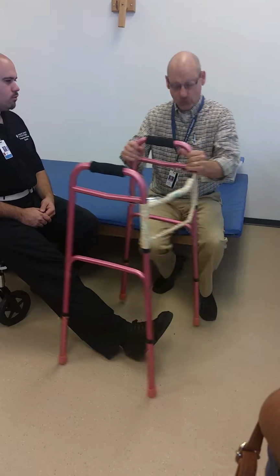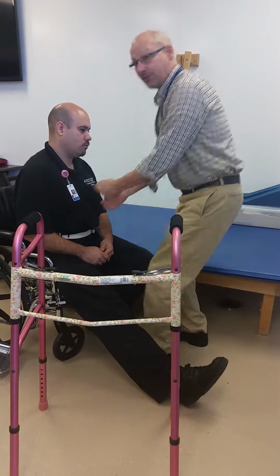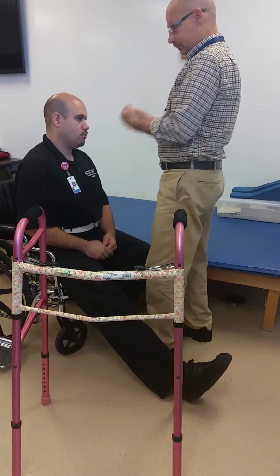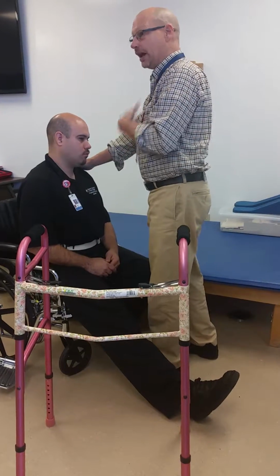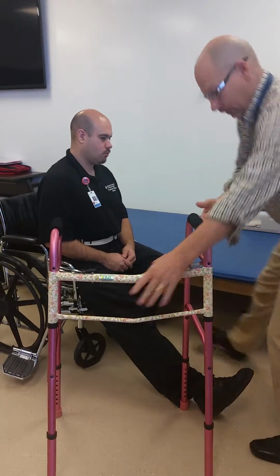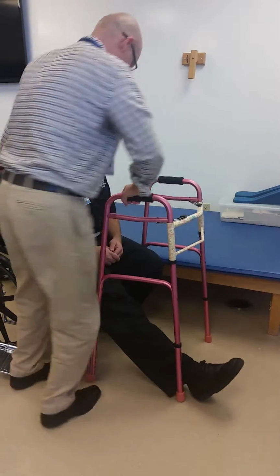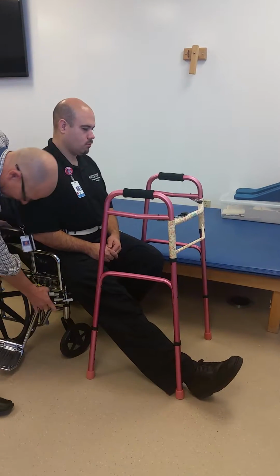So now you got two things to do. We can stand up with the walker one of two ways. I can be in front of Randy and we can stand up. I can assess Randy's stability, how do you feel, anything like that. Then I can bring the walker over. The other way is to put the walker in front of the patient like this. Stand on to the side. I'm going to take this out of the way.